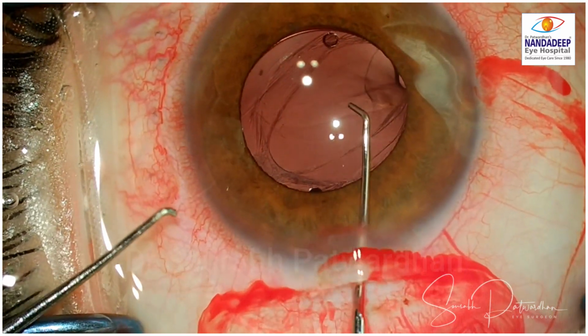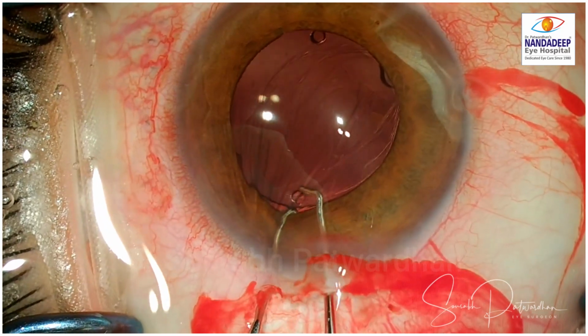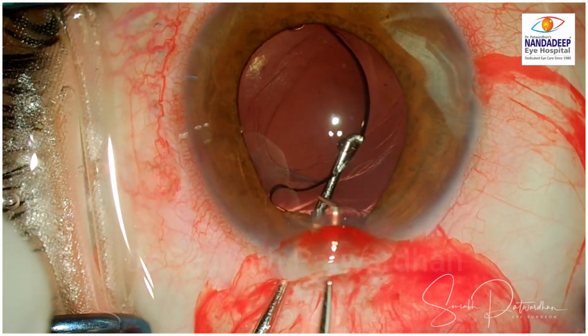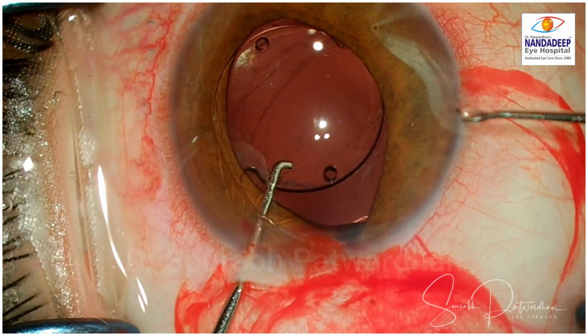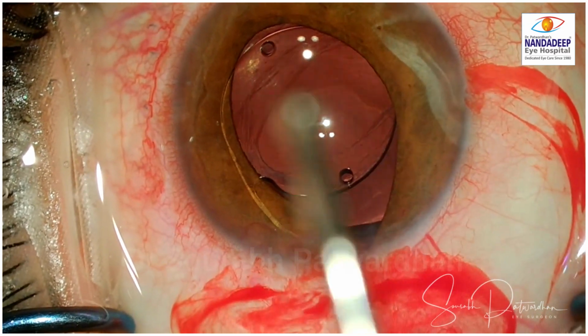I was just checking after rotation of the IOL whether the IOL centers, and it was centering alright, but of course I have to exchange this because of the refractive surprise as well. But I think redialing the IOL is also another option. Of course, here I don't want to take another chance.